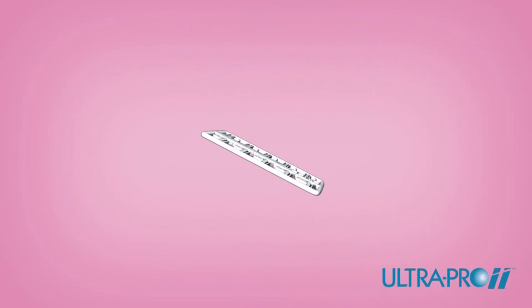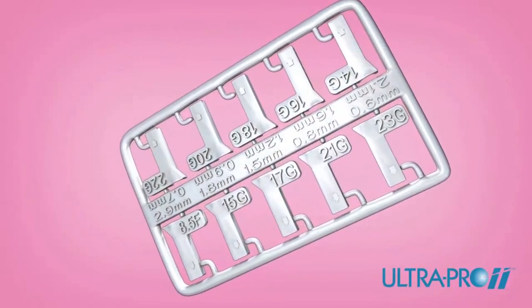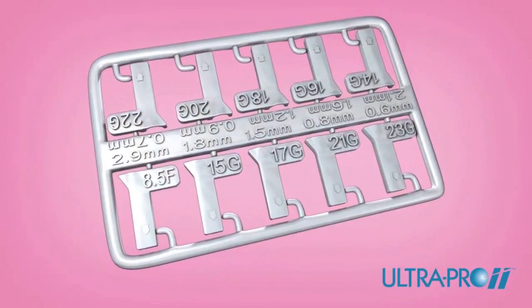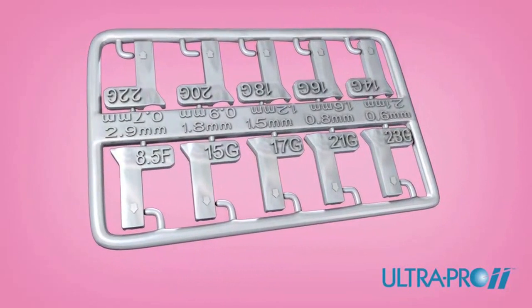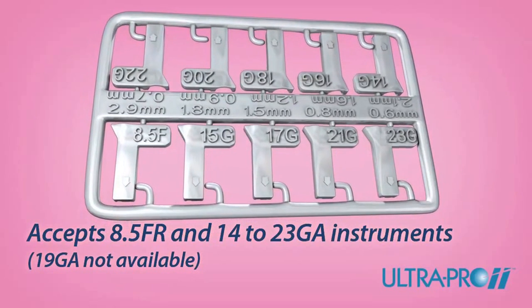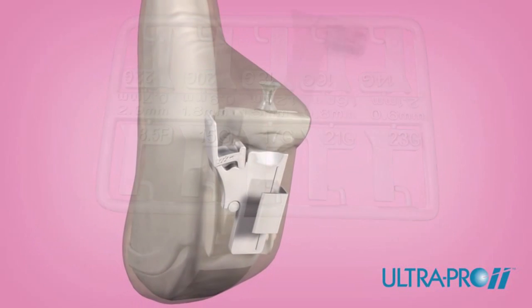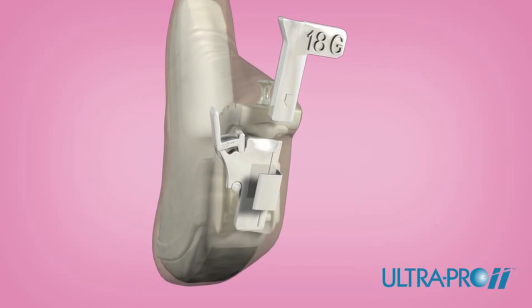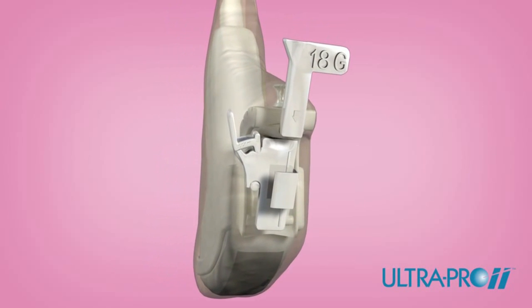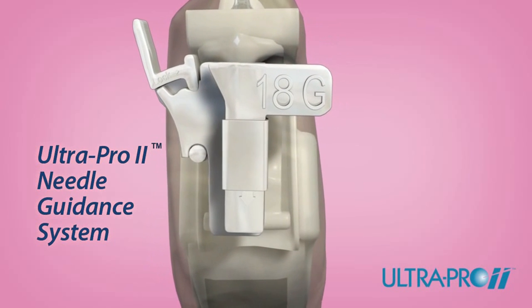The UltraPro 2 needle guide includes easy-to-read gauge sizes for quick gauge selection in a darkened ultrasound room. A full range of gauge sizes are available, including 8.5 French and 14 to 23 gauge. Slide the selected UltraPro 2 gauge insert into the needle guide. The rounded corner of the insert should be visible, extending outward from the guide.